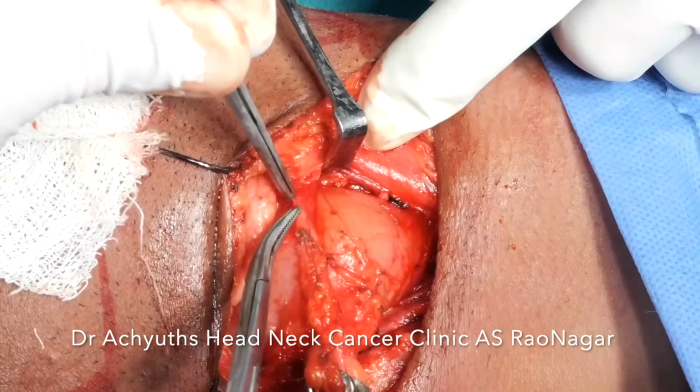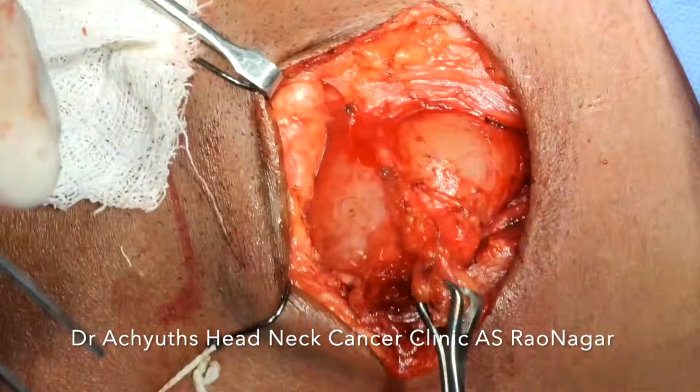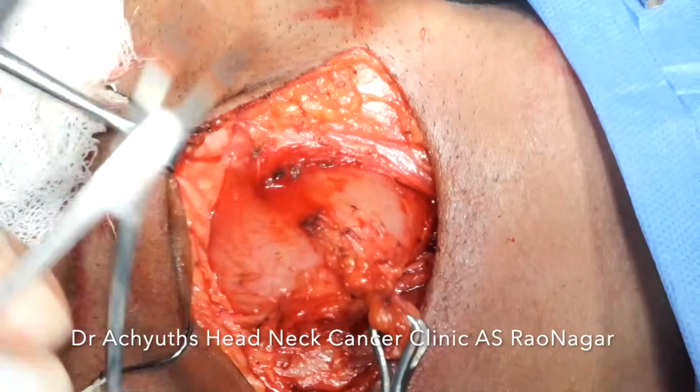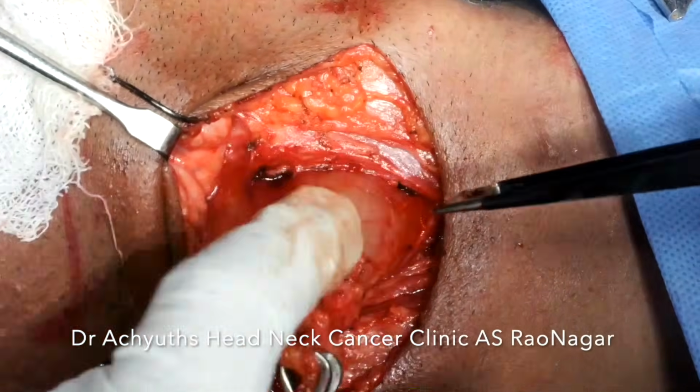This is also fascial structure. So the fascial bands which hold the cyst are slowly released from all the sides, and the cyst is little by little delivered.